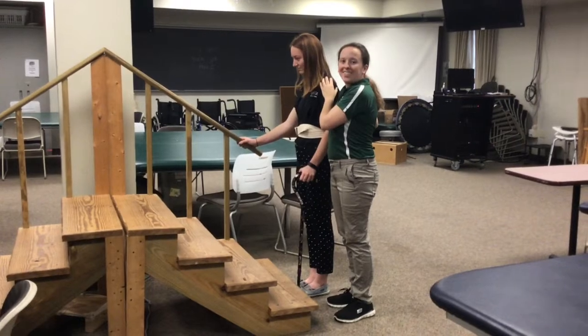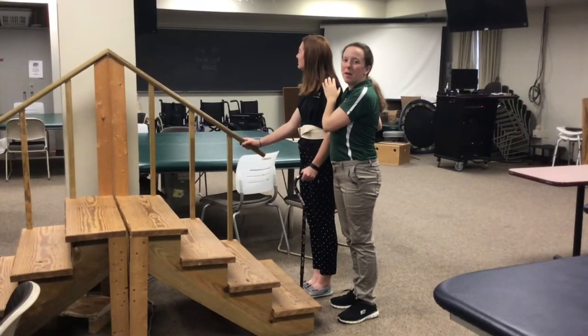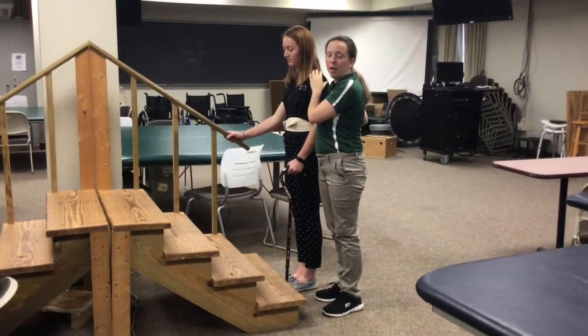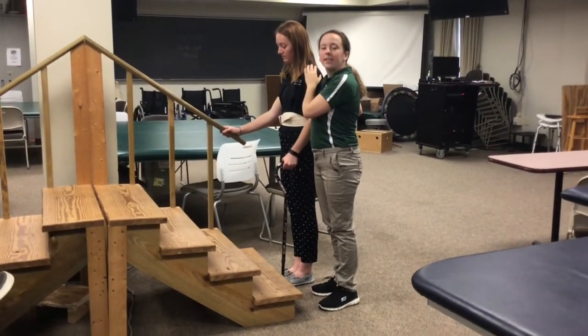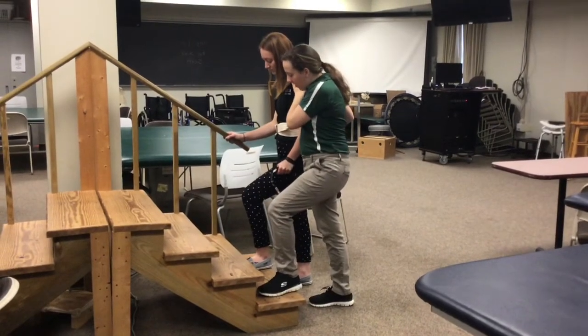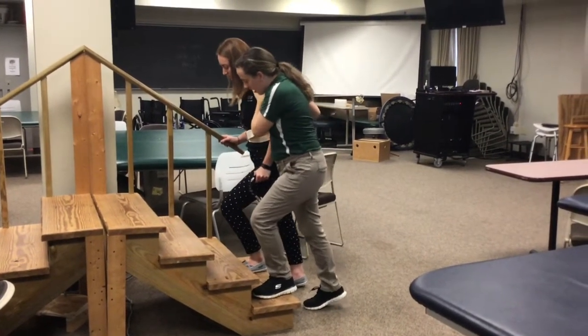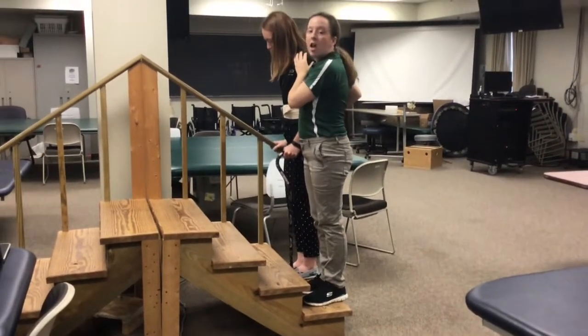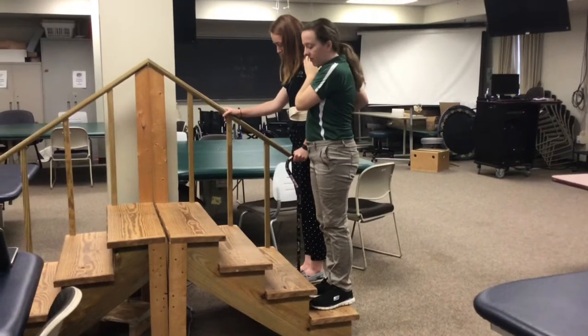Now we will cover how to ascend stairs. You will begin by standing in stride with your patient with a hand on their shoulder and a supinated grip on their gait belt. The patient will begin by placing their uninvolved leg onto the stair, so move up your uninvolved leg, and then can you shift weight onto that and extend your knee, and then bring up your involved extremity and then the cane. And then you will continue that pattern for the rest of the stairs.